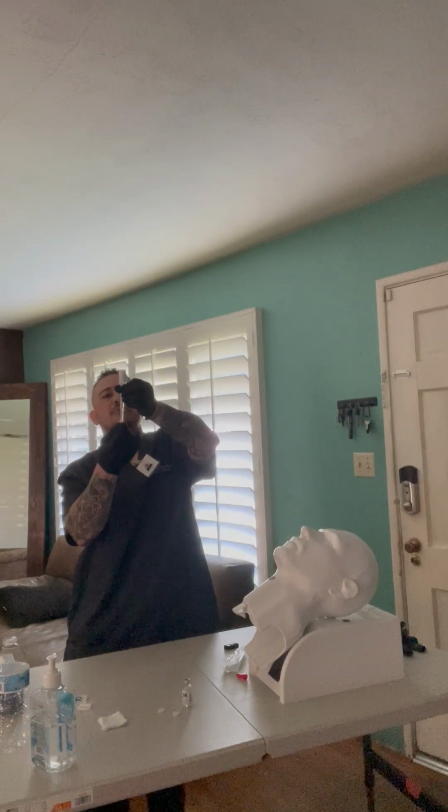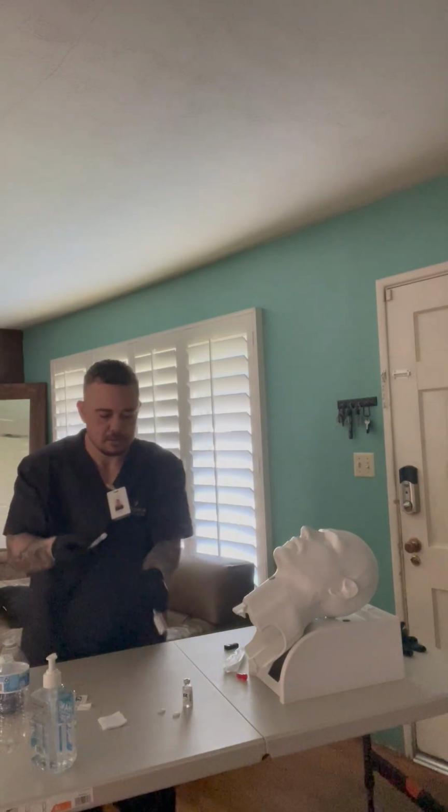I'm still checking to make sure there are no bubbles as well. And I've got my 12 units. I'm going to take that out. So I have my 12 units. I have the 4 units of the regular insulin and 8 units of the NPH, or intermediate insulin, and that should combine for the provider's orders in the EHR on the MAR of 12 total units.